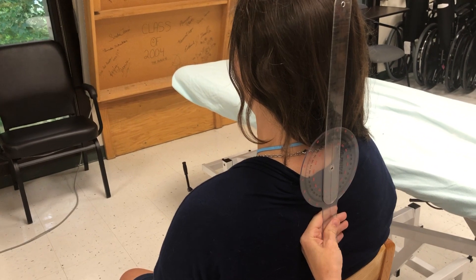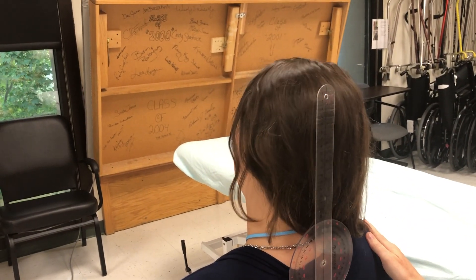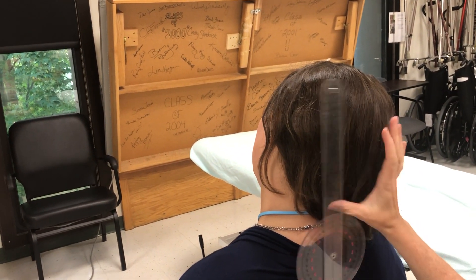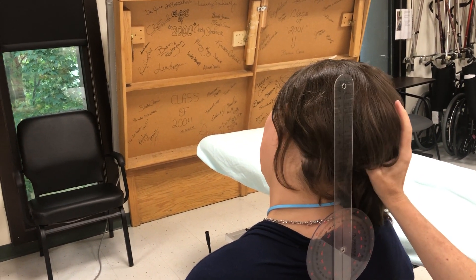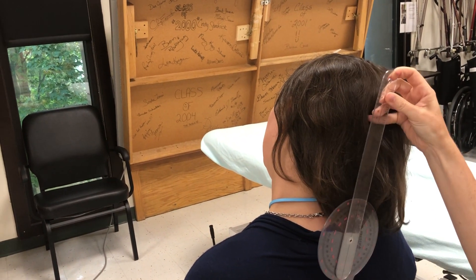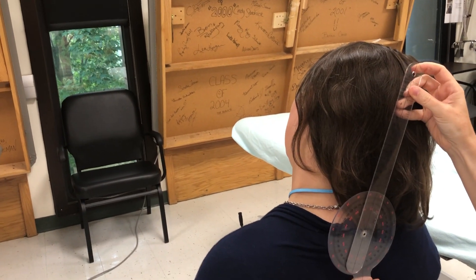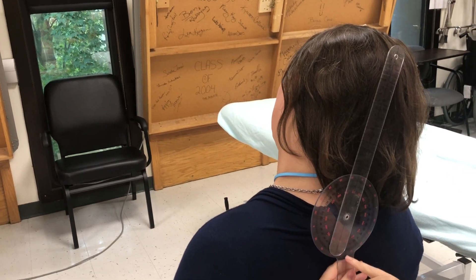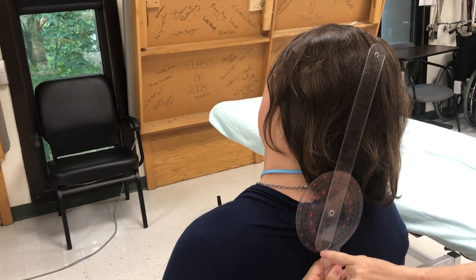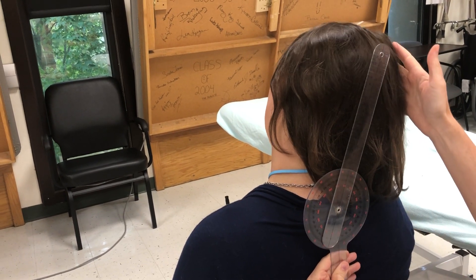My cue is: bring your right ear to your right shoulder. Then I palpate the external occipital protuberance by going up midline, and I line up my moving arm with that. The zero is now a black number and she went 20 degrees to the right.